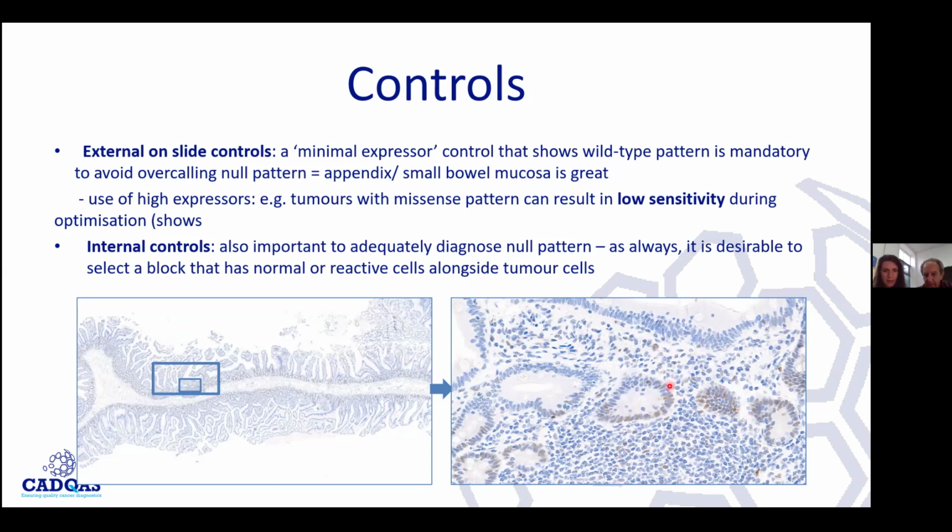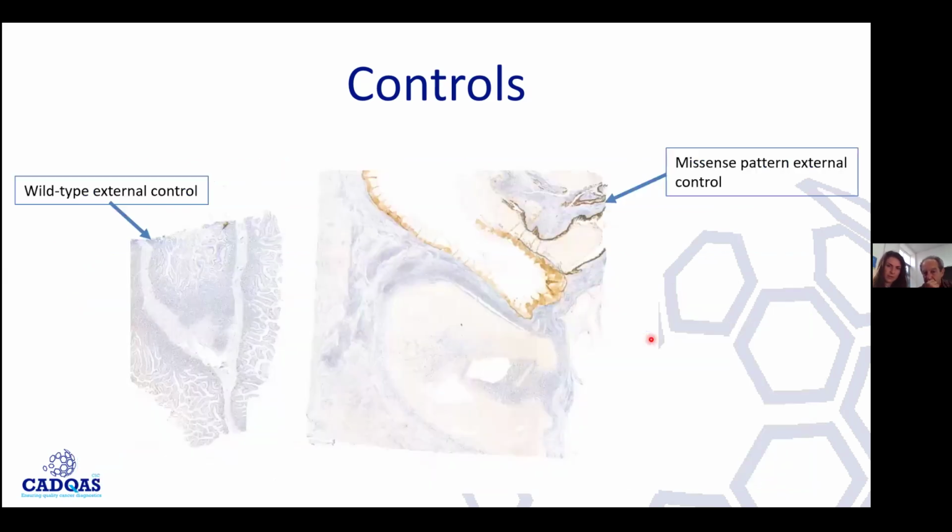Okay. So in any case, just to show this wild type pattern again that Corrado maybe doesn't want to see. And this is also in the right area. Exactly. Whatever part of the gut you choose, it needs to be in the area that is patterning. In this particular one that's where the proliferation fraction is, in the crypts. So not really on the surface epithelium, you shouldn't see any staining. So these are the controls we usually use. We do have a mutated protein. The problem is when you have problems, you need to understand the stain at all, or how bad is it.